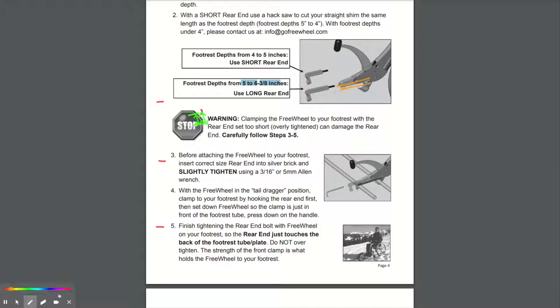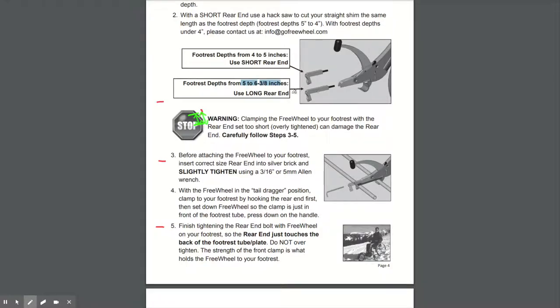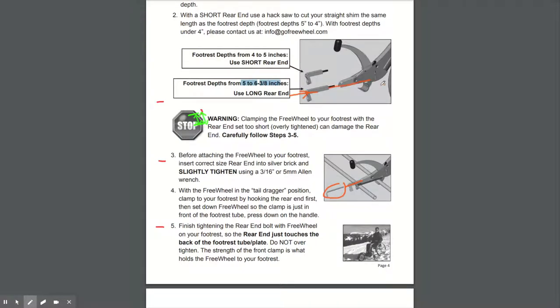So be very careful and slowly push the shim into the freewheel. Then you need to use either the short or the long rear end, depending on what that length or that depth of the footrest is. And then you get the Allen key, which is supplied, and you tighten this rear end into what they call the brick of the freewheel.